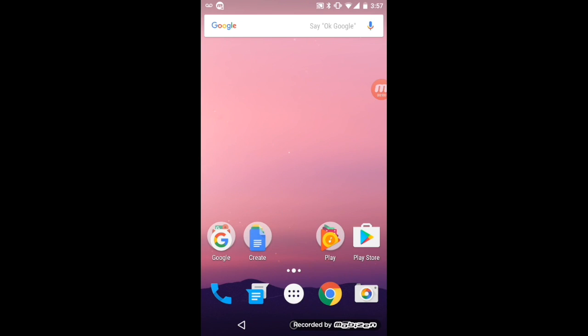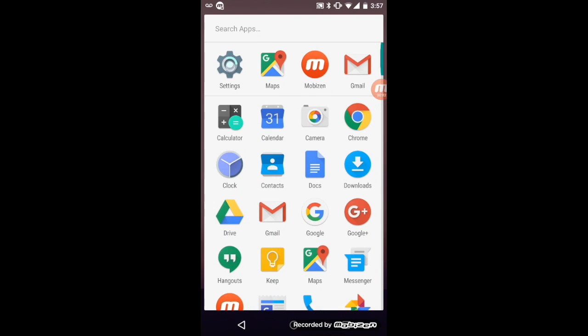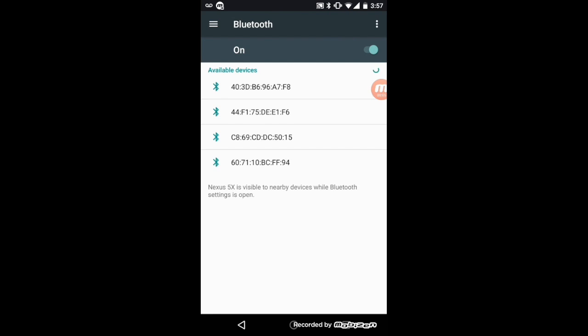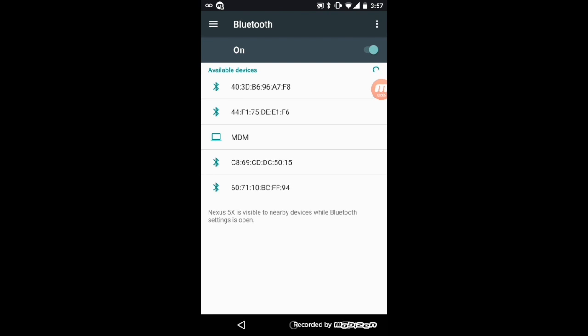To pair your Tecla Shield, go to the settings menu of your device and under Bluetooth, turn Bluetooth on. The device is now searching for Tecla.